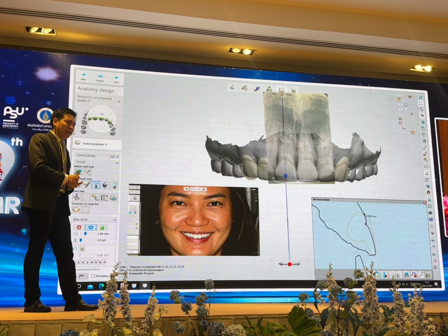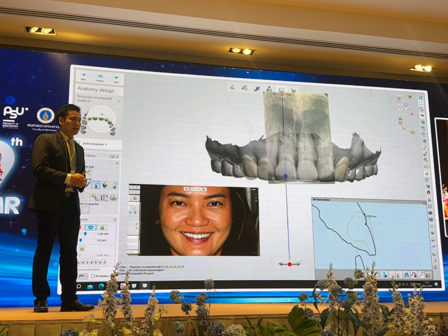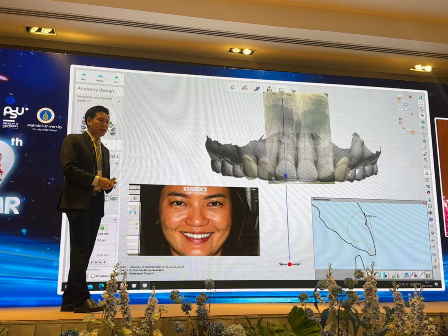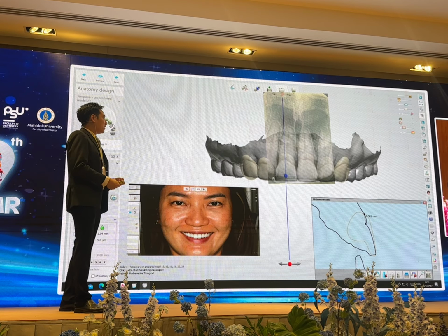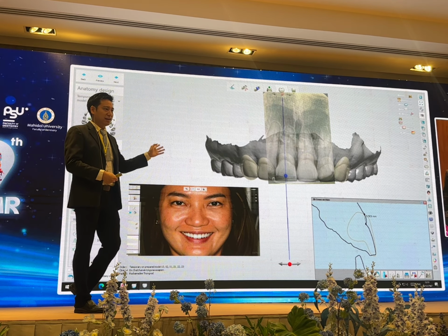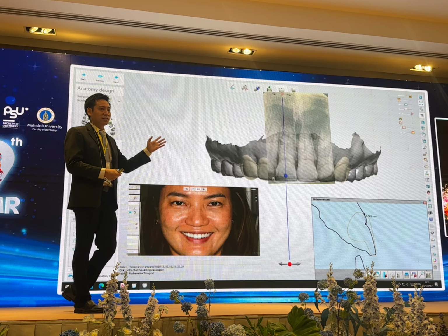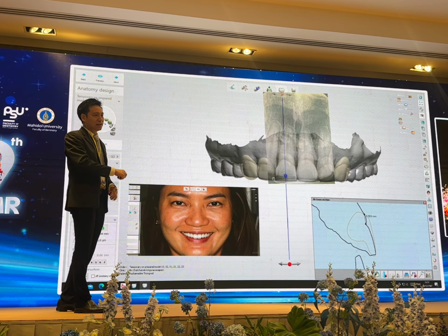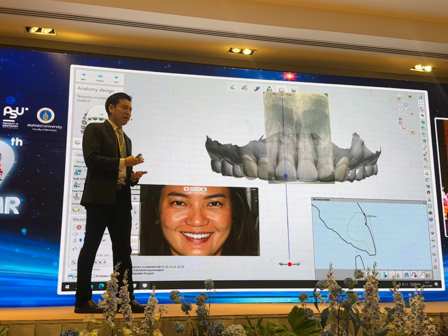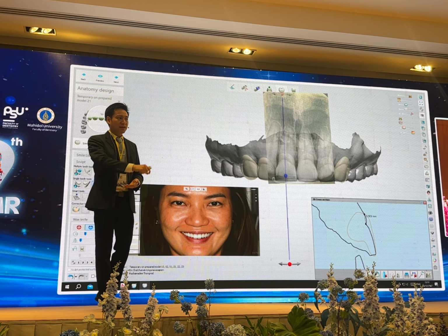In some cases, if you want to perform, for example, aesthetic crown lengthening, you need information like how long the root is, how much bone we need to cut. You need to use an X-ray and superimpose it manually like this, which is not convenient and not precise. So we have now realized that the problem is that 2D is not effective for real-life conditions so many times.